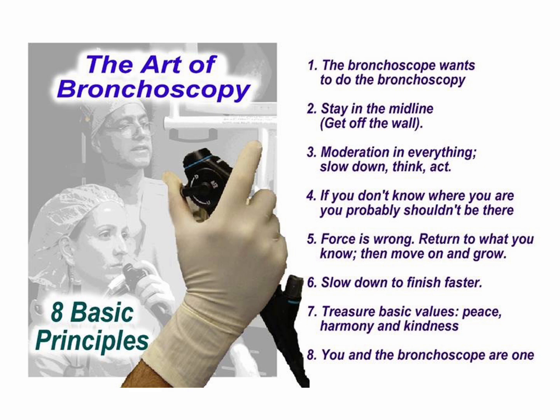Although newer technologies such as endobronchial ultrasound, navigational bronchoscopy, and robotics have expanded diagnostic capabilities, in many settings, conventional TBNA remains an important and highly effective procedure in experienced hands. Mastering its principles not only improves diagnostic performance, but also strengthens the bronchoscopist's overall understanding of airway anatomy, disease, and procedural judgment.